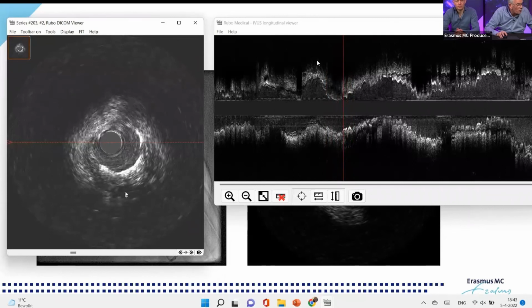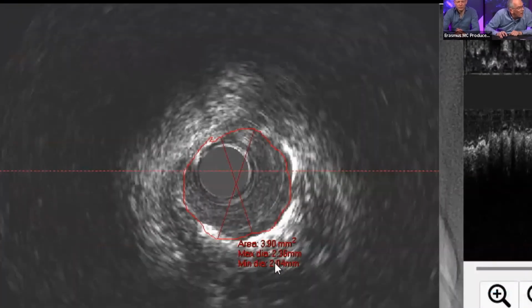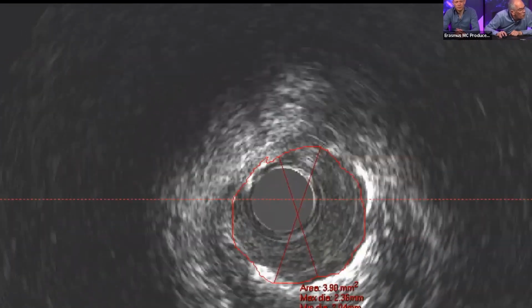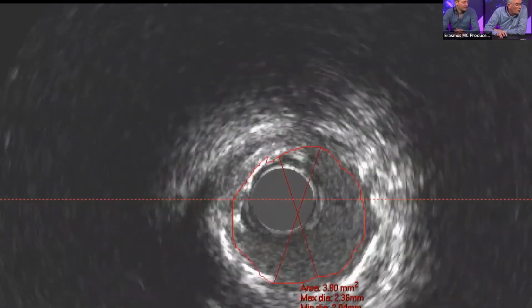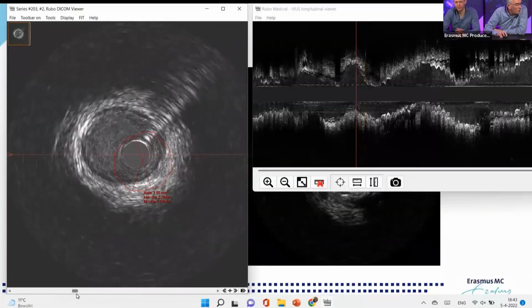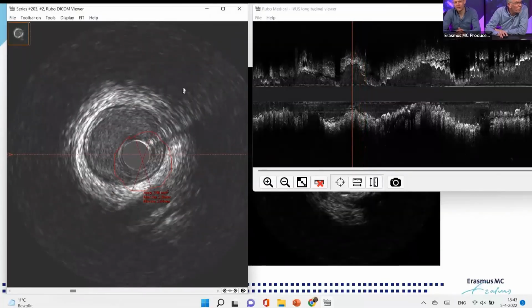Let's have a look at what we did. 2.75 stent. So always remember, long, small stents are typically a recipe for disaster. 3.9. More, yeah. And if you go distal? Distal, we had 7, right? Yeah, we had 7. So there's no need to redo that. So we had a distal reference of 7.